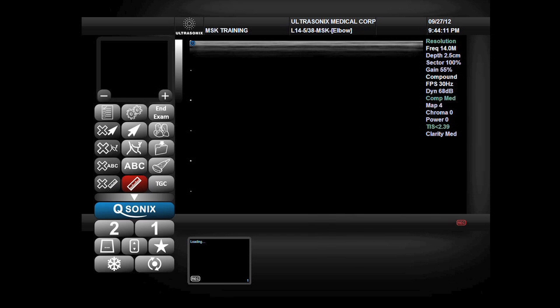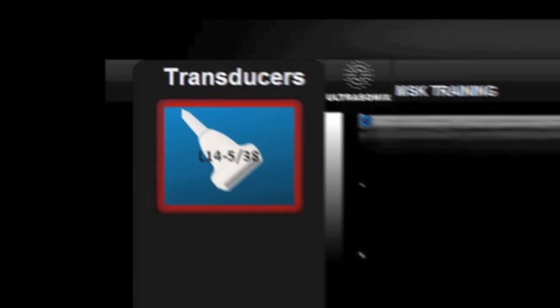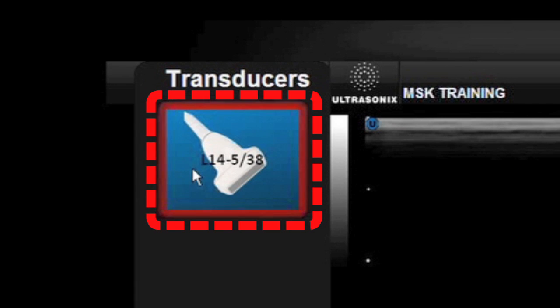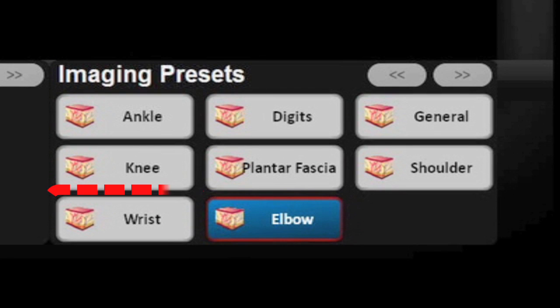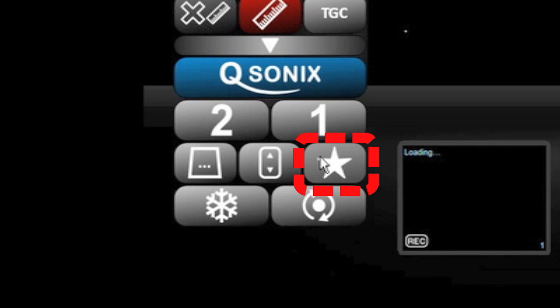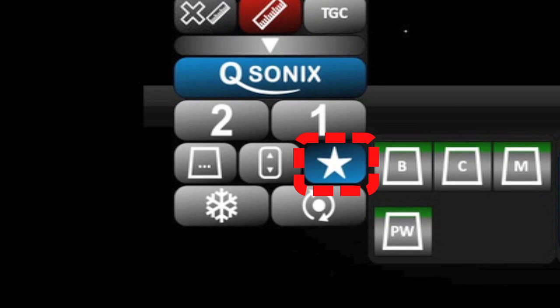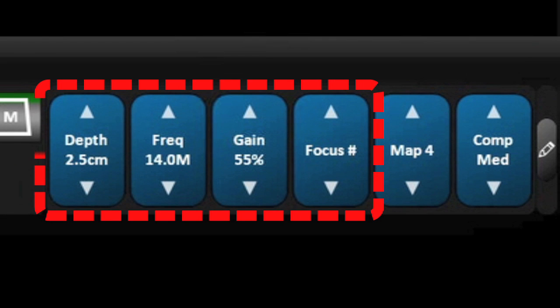Selecting the appropriate presets for the hand and wrist examination, we again select the correct probe — the linear 14-5 probe is most optimal. We choose the musculoskeletal application and the wrist preset. Pressing the favorites drawer opens our ability to change the depth, frequency, overall gain, and number of focal points.